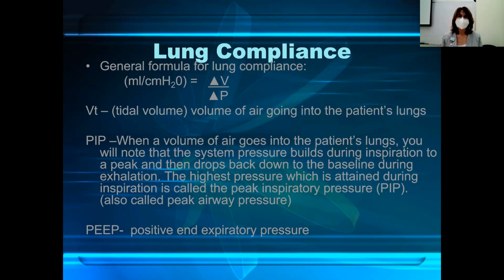That's the highest pressure. So as the air goes in and fills up the lungs, you'll see that the pressure just keeps building and building as the air is going in. And then inspiration ends, the exhalation valve opens, and now all the air comes back out again. So the peak inspiratory pressure is the highest pressure that built up during inspiration.